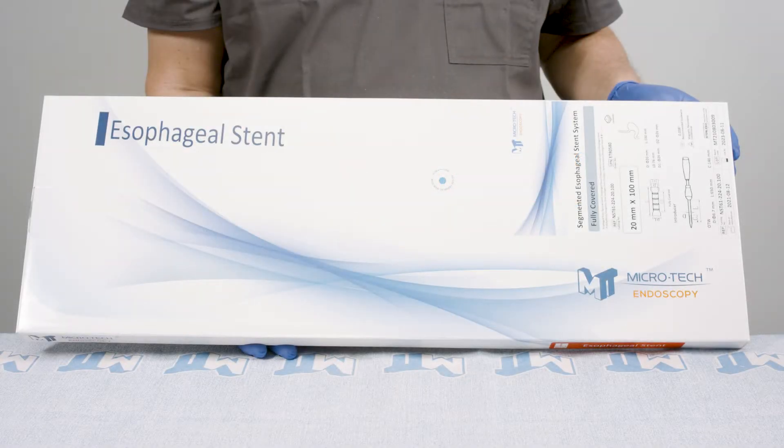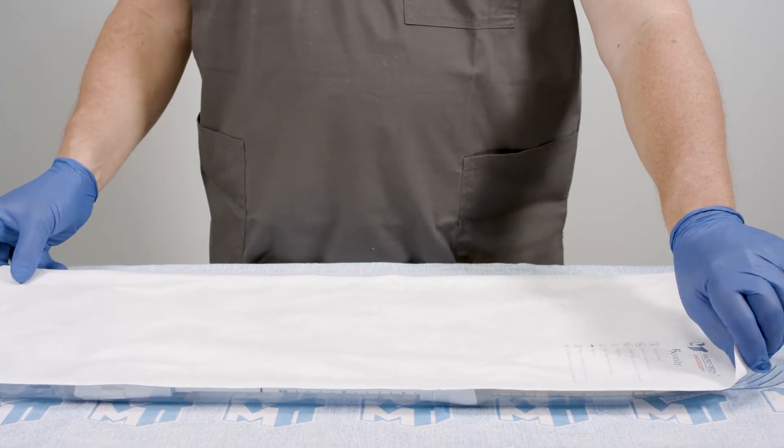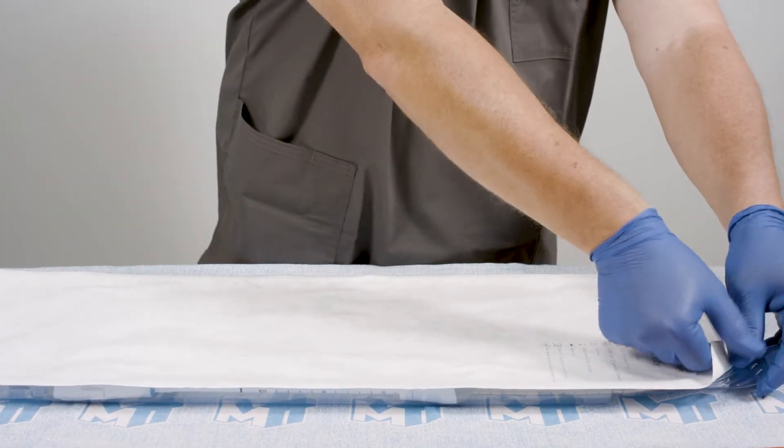The Micro-Tech esophageal stent comes packaged sterile, one per box. The labeling includes the order number, date of manufacture, and use by date. Within the box is the plastic tray with Tyvek lid.